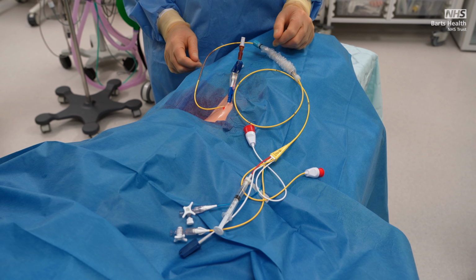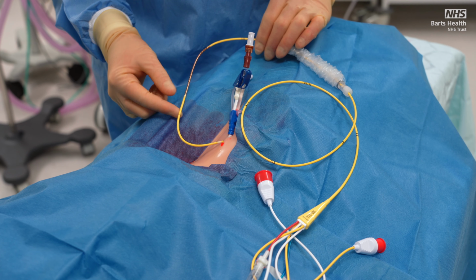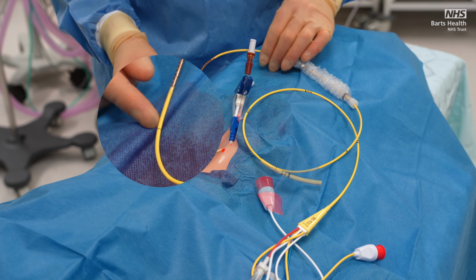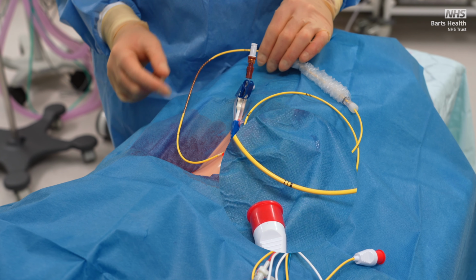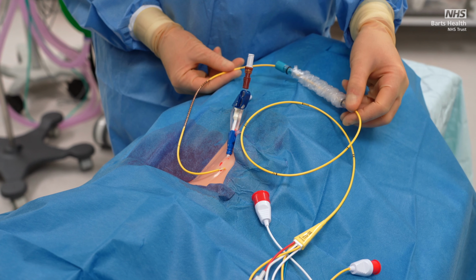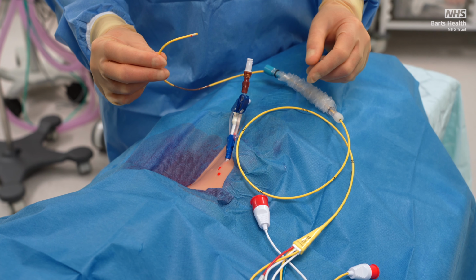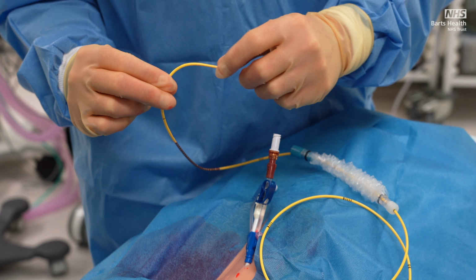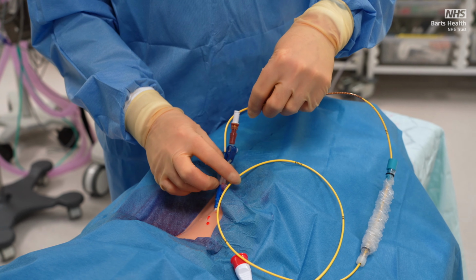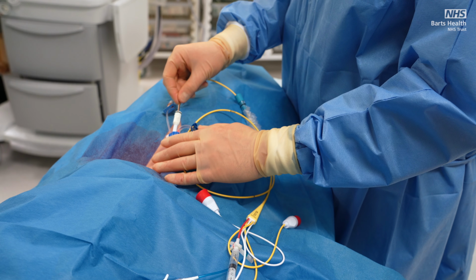Identify the markings on the catheter which demonstrate depth of insertion. A thin black line identifies a 10 centimeter marking. A thick black line identifies 50 centimeters. You should also identify the thermistor on the catheter, which is where the temperature is measured. Insert the catheter into the top of the introducer sheath until you advance beyond the metal plate.